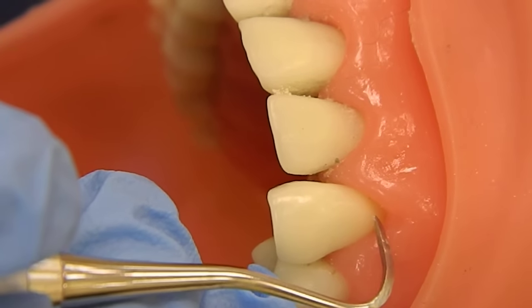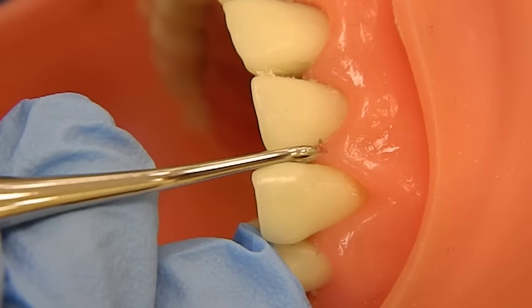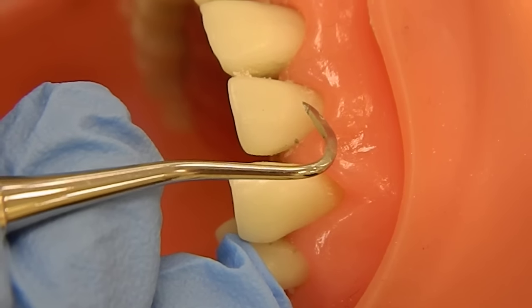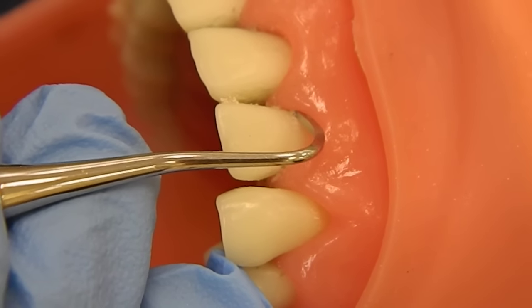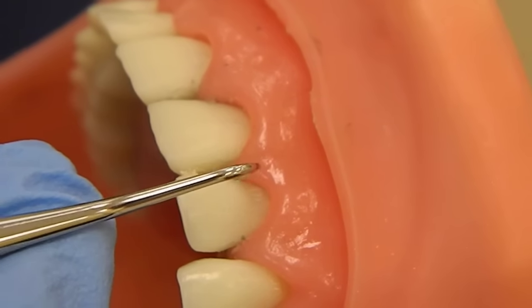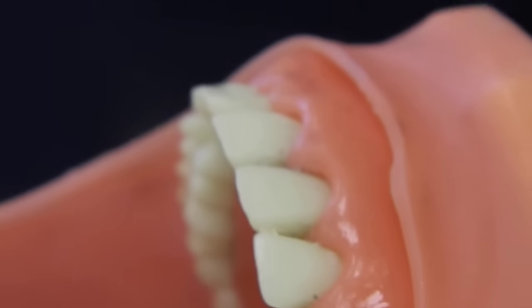Go to tooth 11, overlapping that midline, turning really fast so we don't poke the gum line. Another thing to remember: we don't follow the gum line when we're turning — we always follow the tooth. If we follow the gum line, we're going to poke the gums. We have to follow the tooth, turn, hug that tooth, and that's how we do the towards surfaces.